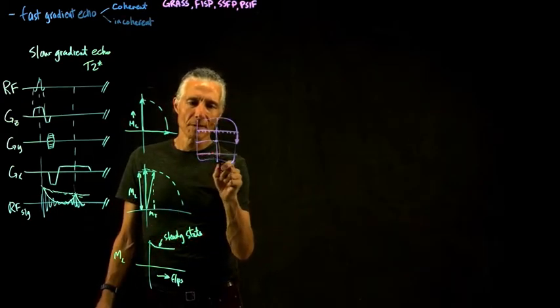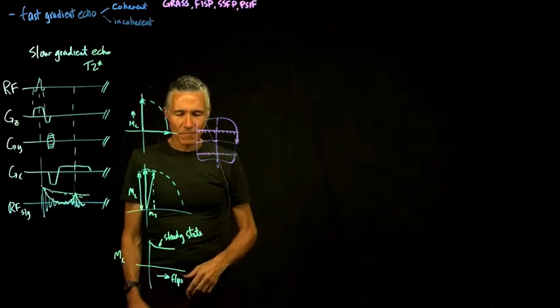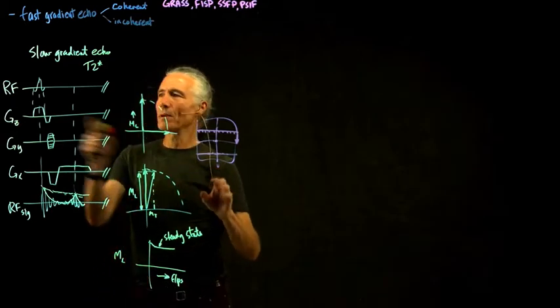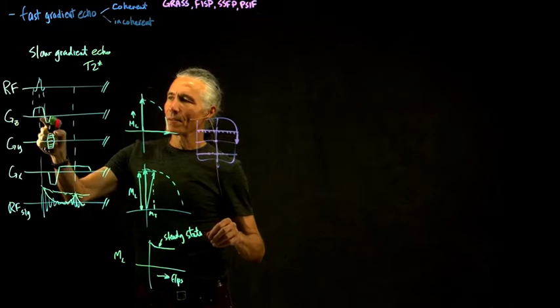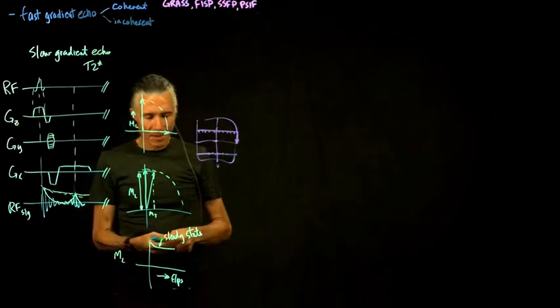Who knows? It could be in a different place. But the idea is that since you've got leftover magnetization, you kind of repair it and put everything back, very similar to putting back the slice select pulse. So that's the coherent one.